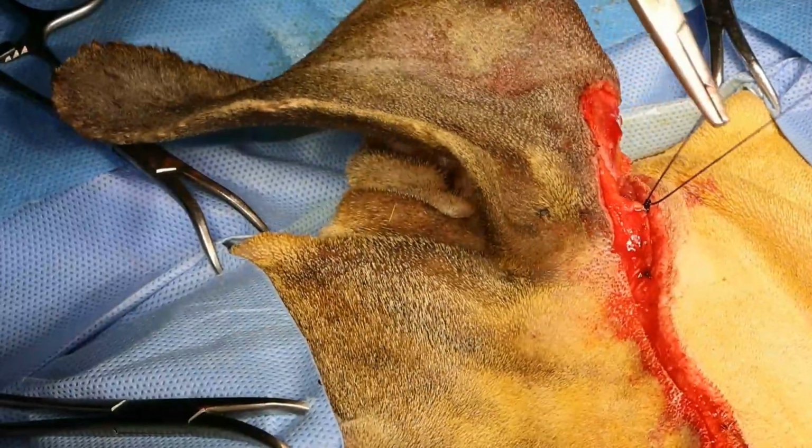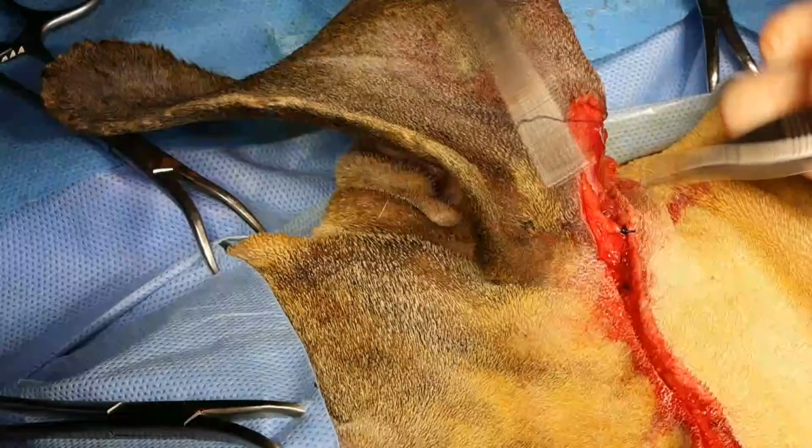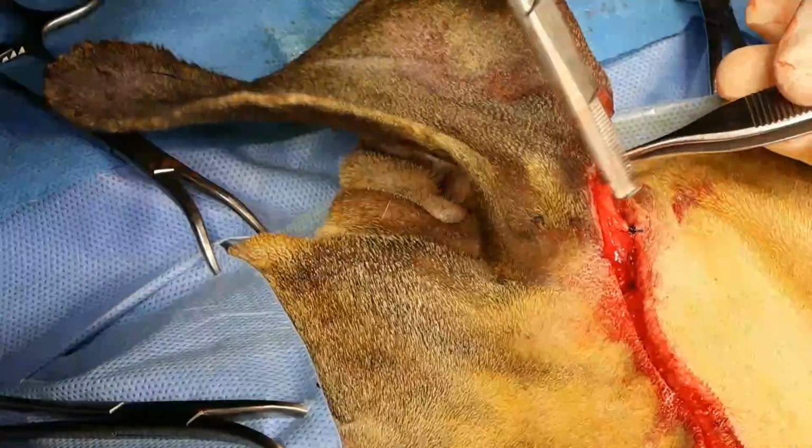Interesting to put a pulse ox on this ear and make sure that we've got a pulse wave. I'm sure it's going to be fine because I've got bleeding from the edges here.